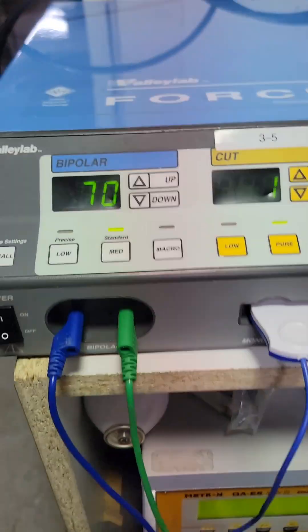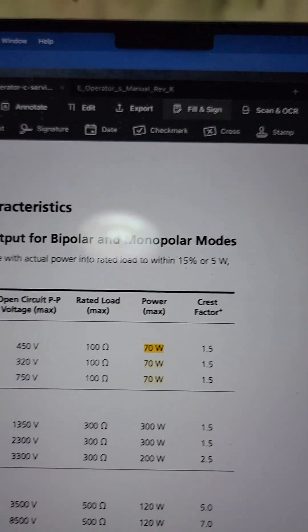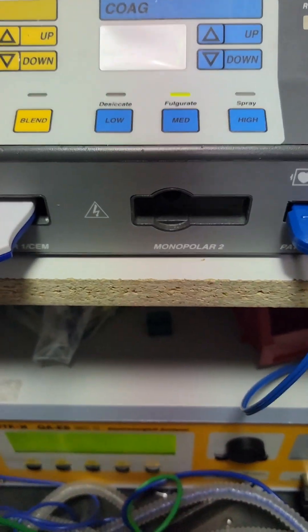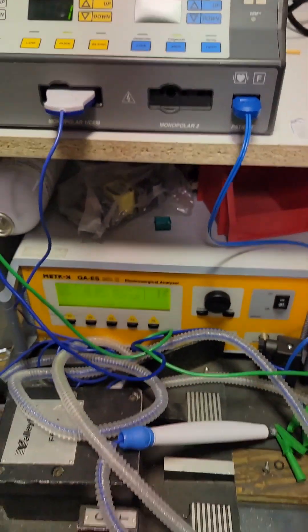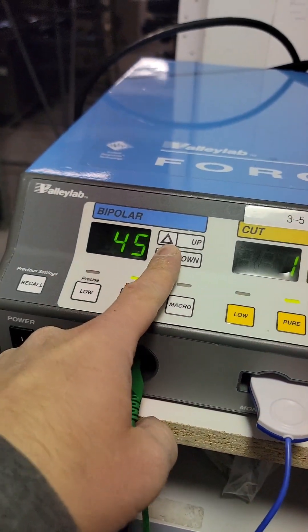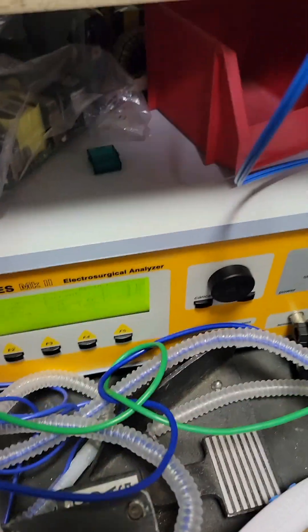Bipolar, 100 ohms, we are set at 70 watts. Hit the pedal and we are 64 watts. For bipolar and monopolar, anything within 15% or 5 watts — whichever is greater — is the allowable tolerance. So 70 watts reading 64: that difference is 6 watts. 15% of 70 would be about 7 watts, so we are less than 15% off — therefore we pass. Next we go halfway, check 35: reading 33, definitely within spec. Bipolar passes.